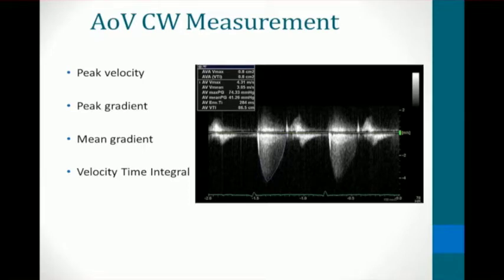If it's very challenging to find the velocity, using an imaging enhancer may help to bring out the signal. Though a word of caution, to not measure feathering in the Doppler signal and to optimize your spectral Doppler display.